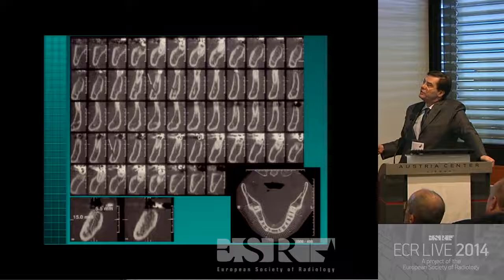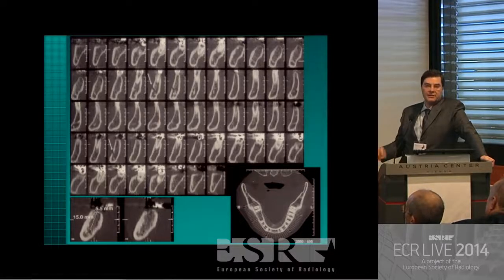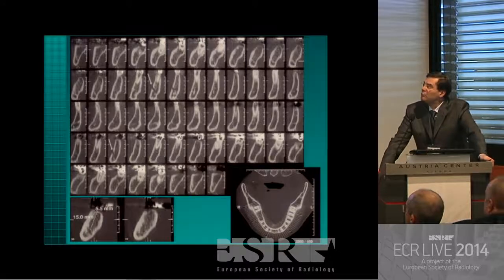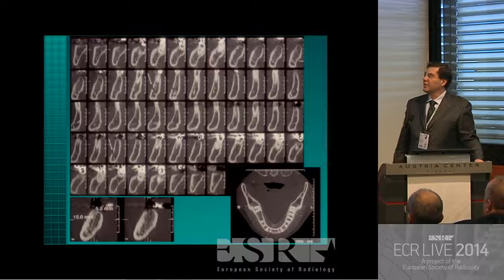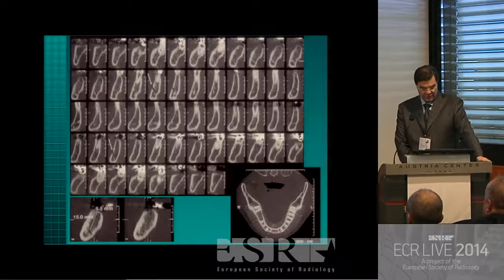You can measure how much bone you have. So even the width you can measure easily and see that this is more than 10 millimeters of height. So you can choose practically any implant which you want. No special implants needed.